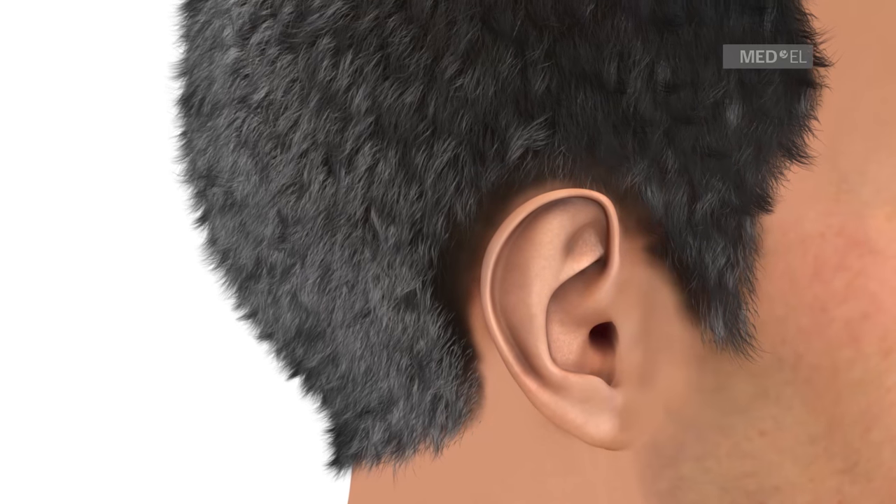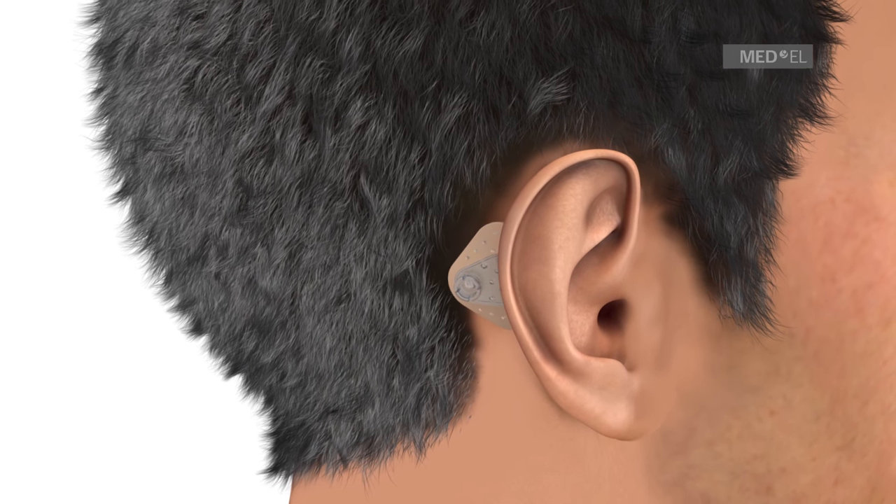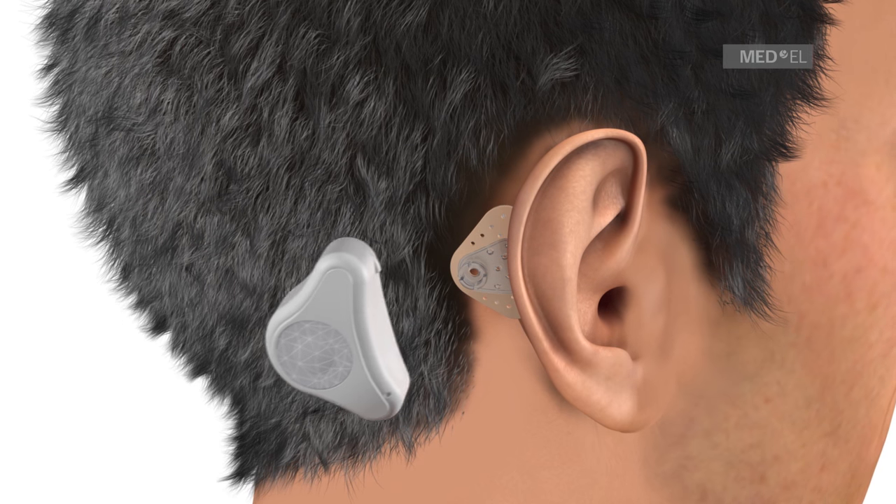The Adhere Adhesive Adapter is applied to the hairless area behind the ear. The Adhere Audio Processor is then connected to the Adhesive Adapter via the snap connector.